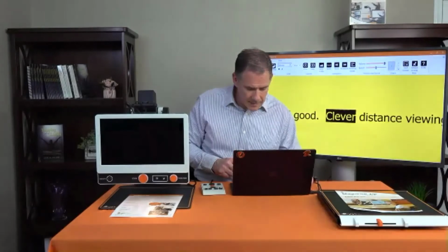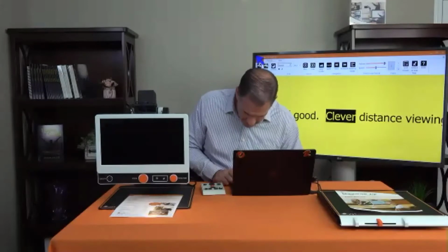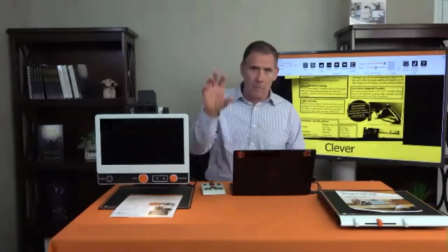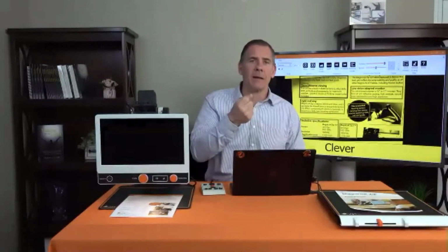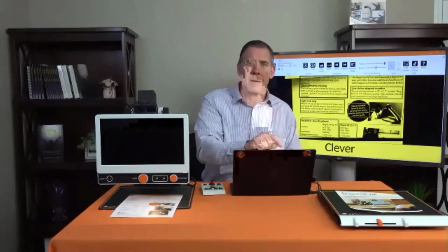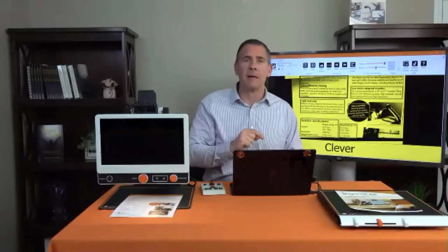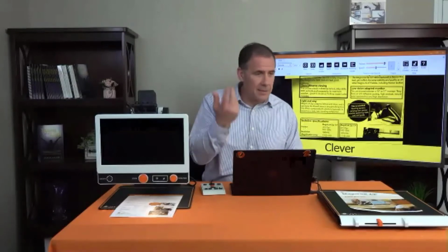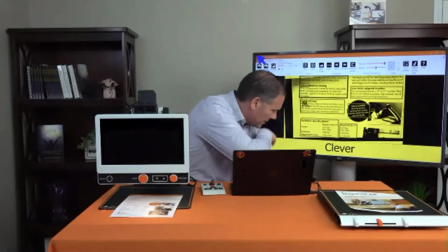Oh, I hit escape. Phew. Okay, so V gives me the different views. I can have the document and all the zones. So in a document, each block of text it recognizes, it puts a box around it. If I wanted to touch my screen in a box, it will start reading if I have a touch screen. I can use a mouse and click inside a box on a word, it'll start reading. I could view a picture on a page and listen to the description, or I can follow the text along down here.